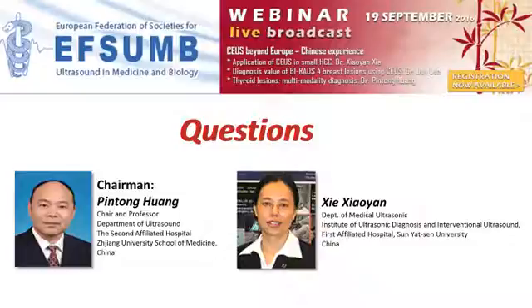So in this case, should we also perform CEUS? Normally contrast ultrasound comes before contrast CT in China. Maybe the patient has rising AFP or something else. So we can scan the whole liver in 2D, and then we use the contrast for the liver.